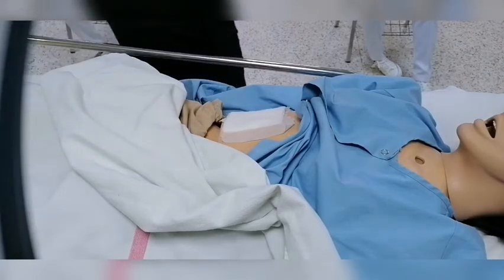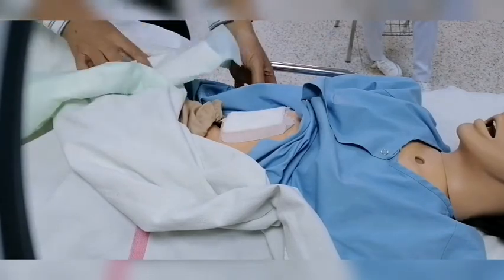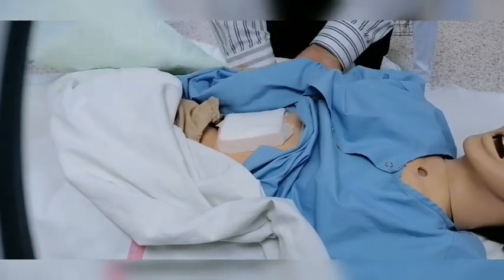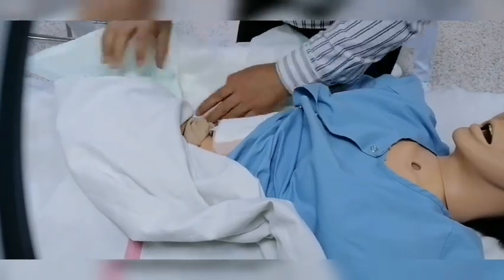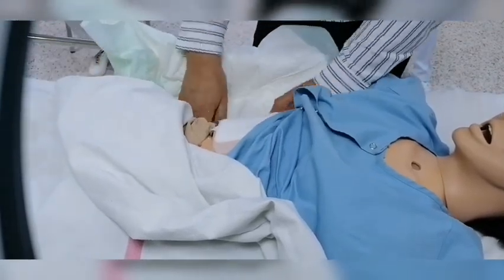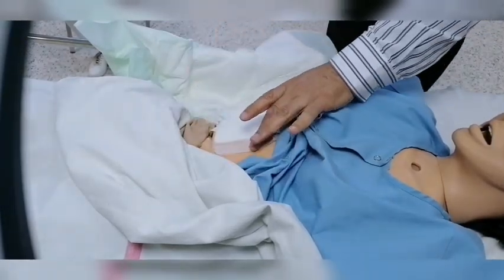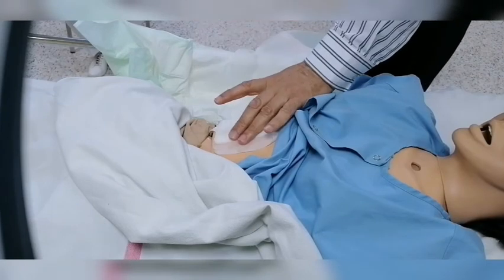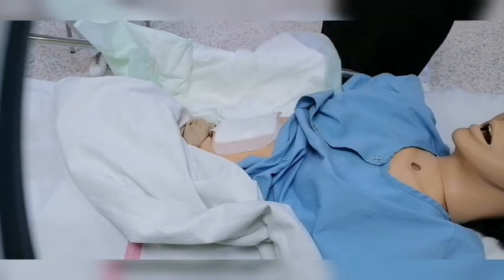I have also to put an incontinent sheet, because there might be secretion coming out, or also to protect from the fluid that I am using for the cleaning of the wound. When I expose, I have to expose just the side that I want to work on. This is to avoid embarrassment of the client, and embarrassment for yourself.